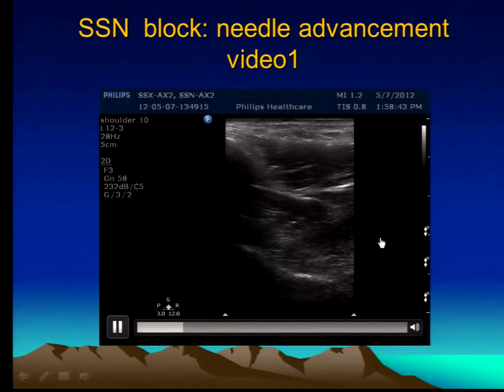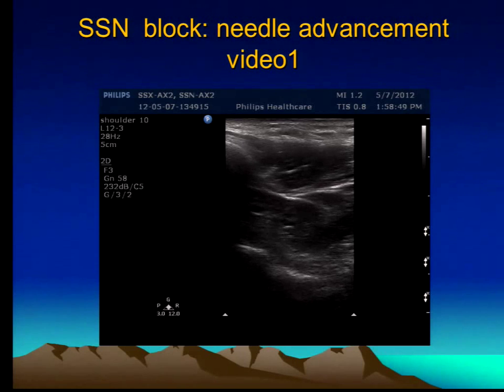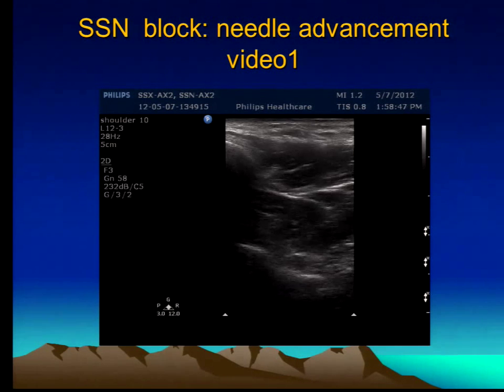Here's a picture. This is done out of plain, of course. You can see how the needle is coming down and touching bone. In this particular case, I could not see the artery or the nerve, and my reference point was just to touch the bone.